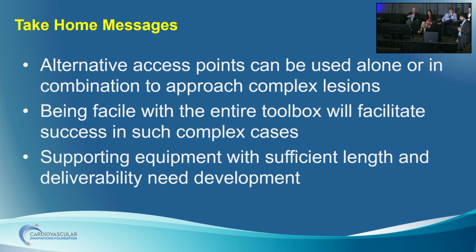To summarize, alternative access can be used alone or in combination to approach complex lesions, and piggybacking off of the conversation from the last session, I think radial sometimes is paired with pedal quite nicely and able to accomplish things that you can't accomplish using one alone. And then you certainly want to be facile with the entire toolbox. And I think we continue to need development in shaft length so that we can deliver more things radially if we so choose.